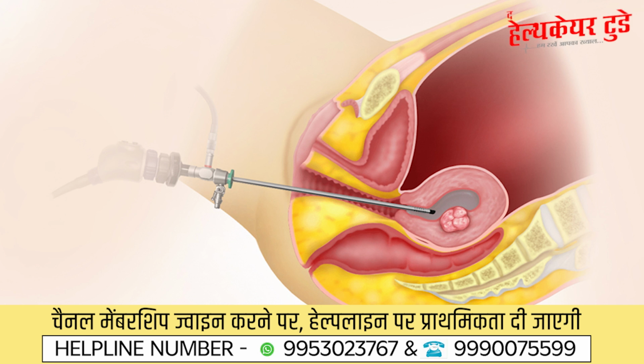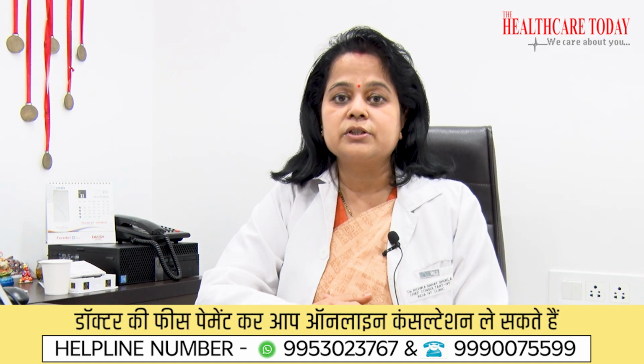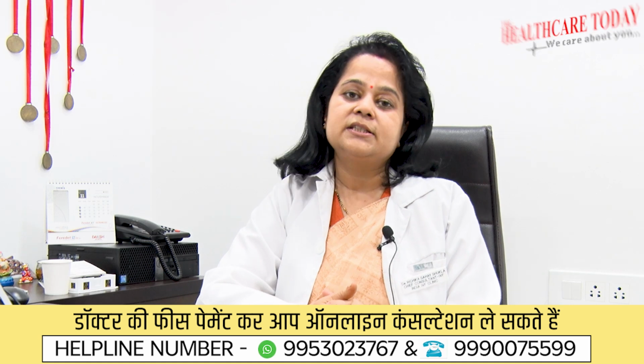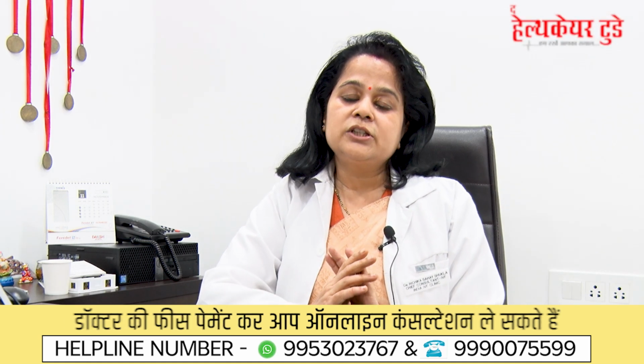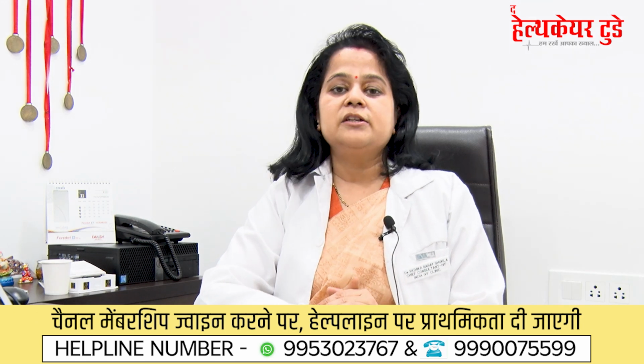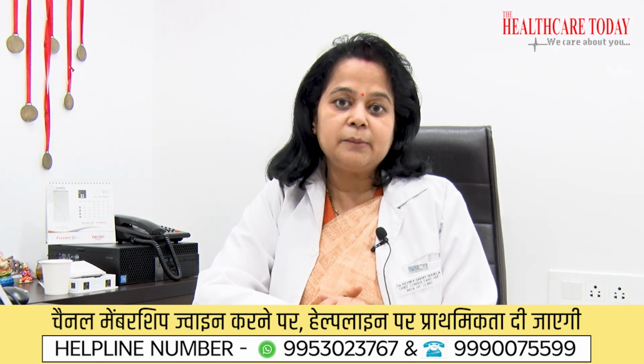And during hysteroscopy, we can improve your uterine cavity and we can increase the blood supply going inside the uterus. Secondly, we can cure the defect that is present in the uterus, like if there is a septum or something, we can definitely remove that defect so that it increases the chances of you having a live baby.